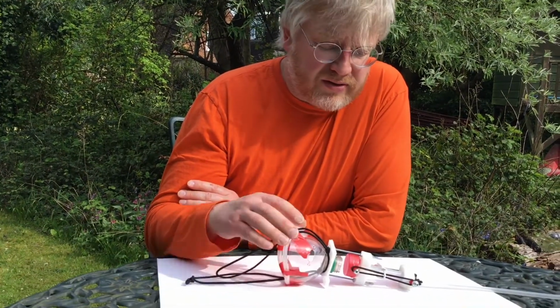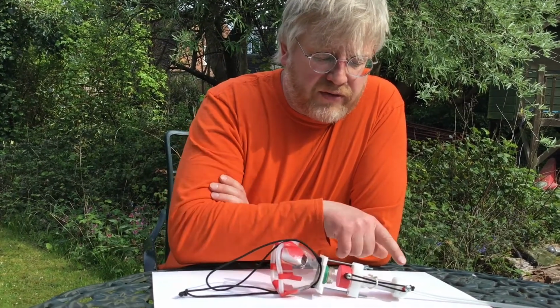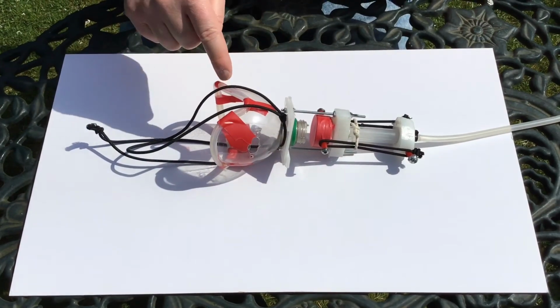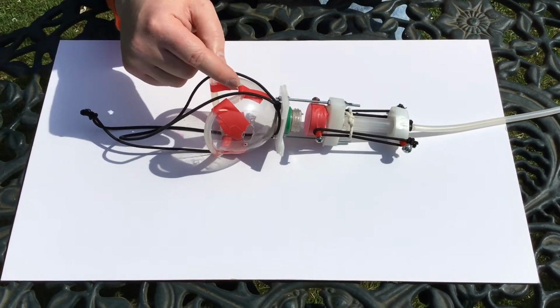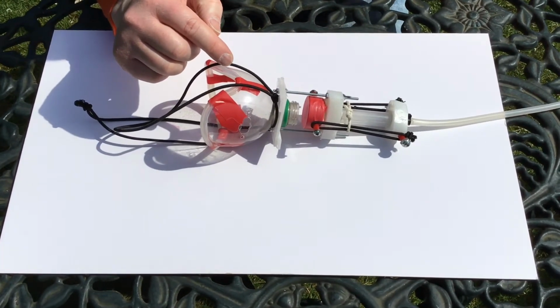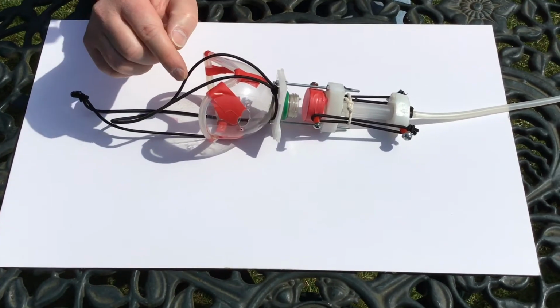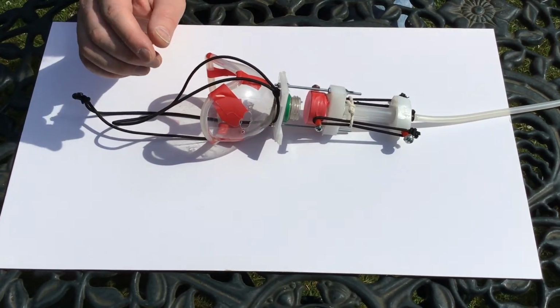The ventilator mask we'll talk about today comprises of a soft drinks bottle and a syringe joined by a few bespoke plastic elements. Let's give you a quick introduction. Here we have the end of a 2-litre carbonated drinks bottle that has been shaped to fit a typical face, and it fits both my face and Frances's face. And as Frances will attest, her face and my face are quite different. So given that it was easy to make it fit 2 different faces, one might imagine that it will fit a good number of other faces as well.